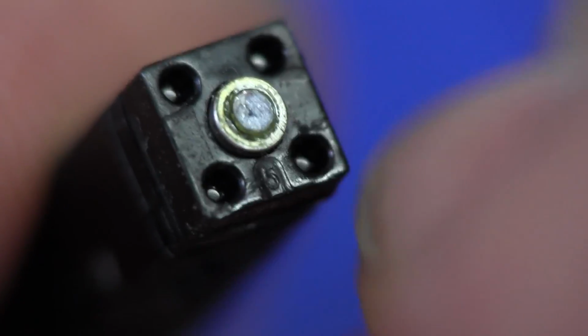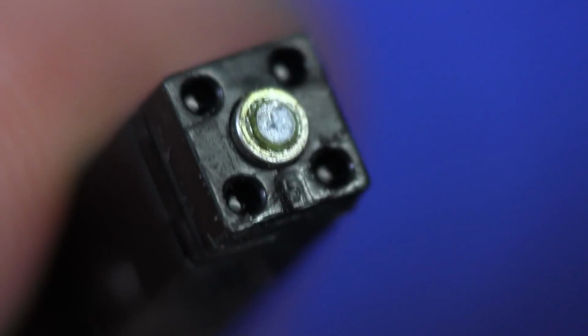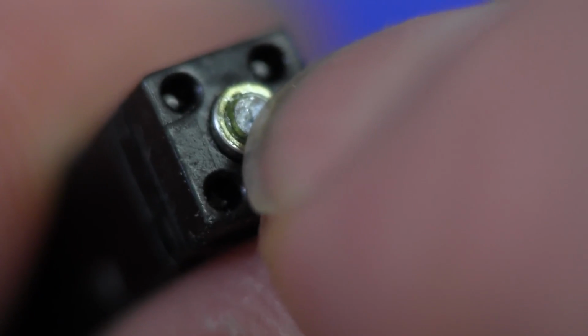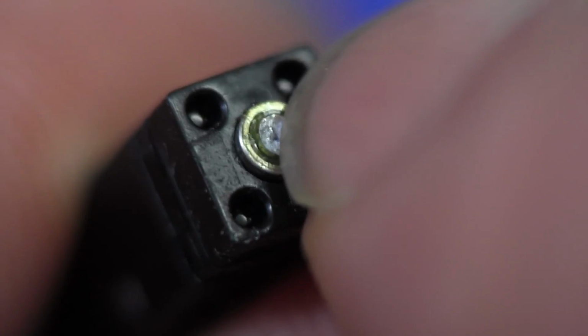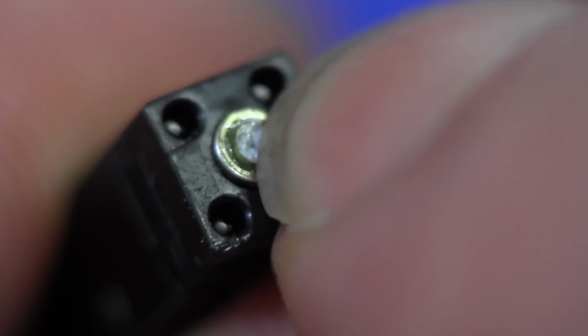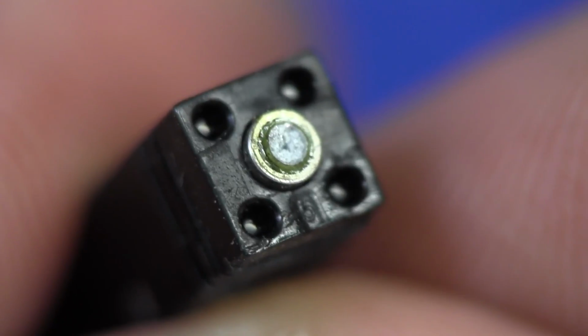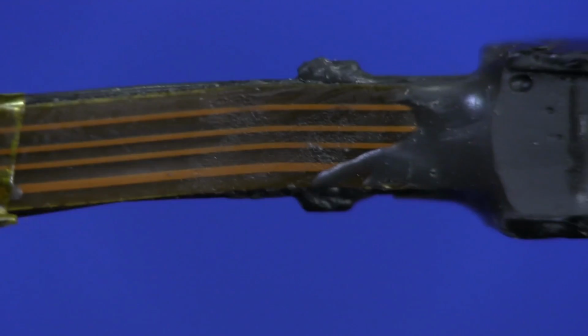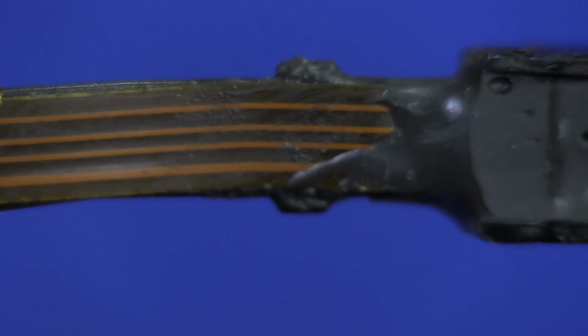in there. So maybe they attach the test probe, and when you put the probe on, it pushes the switch down like that, which then puts the thing into programming slash test mode for production or whatever, and then you use the 2-wire interface, ground and data there. So it's essentially a 1-wire interface to do whatever they need to do during production, I presume. And of course that makes sense if you remember before going into it, this 4-way flex membrane. So you'd have 2 wires for the tactile switch and the other 2 for the external contacts.